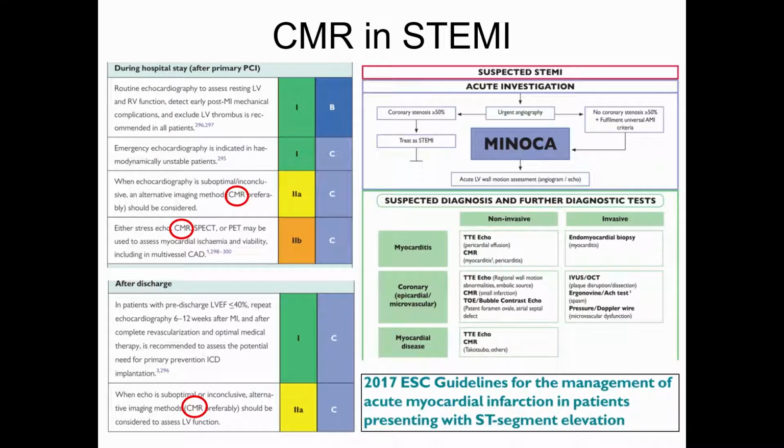They may have a missed infarct because either the interventionist has missed a small branch that's occluded and you just didn't spot it on the angiogram, or it's been spontaneous reperfusion. But the MRI would tell you very clearly that there's evidence of infarct, so that would be a very helpful test to say, well, actually the angiogram's fine. It's not fine, they've had an infarct and we can see it. Or they may have Takotsubo, hypertrophic cardiomyopathy, or other cardiomyopathic presentations.